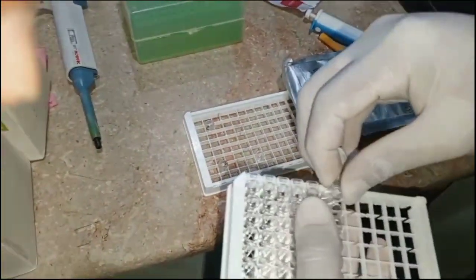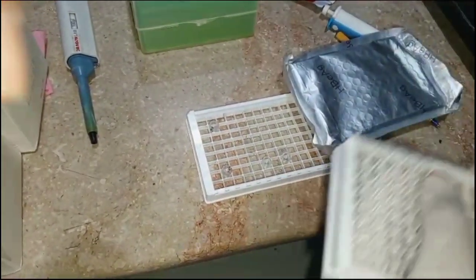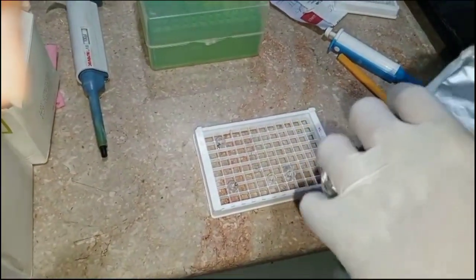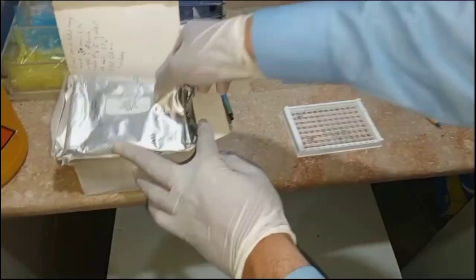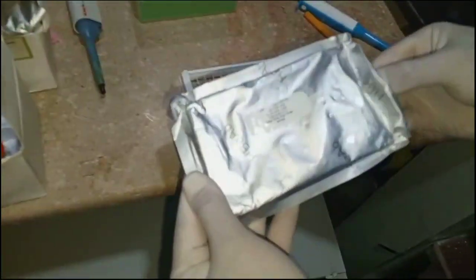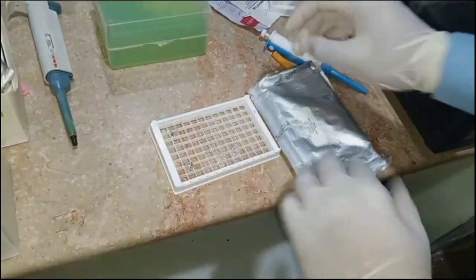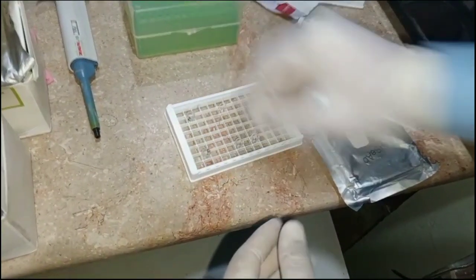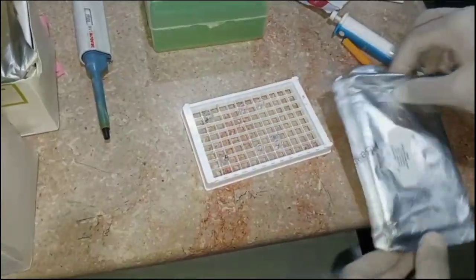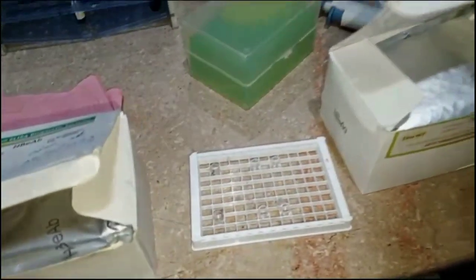The second well that we have taken for HBeAg and Ab should act as a positive control, while the third well that we have taken for HBeAg and Ab should act as a negative control. So in the second well of HBeAg and HBeAb, we should add positive control, and in the third well of HBeAg and HBeAb, we should add negative control. We can also say that the upper row is the HBeAb, and the second row is the HBeAg.